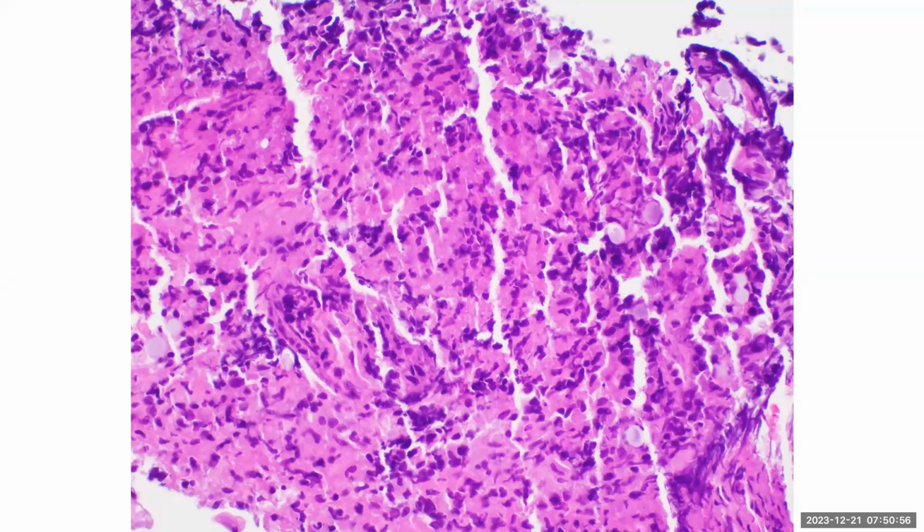There's some pleomorphism in that the nuclear shape and size are different. It's really difficult to say much on the H&E stain here. There's some artifact on the right side smearing out. This happens in lymphomas. So, a possibility is a lymphoproliferative disease here.